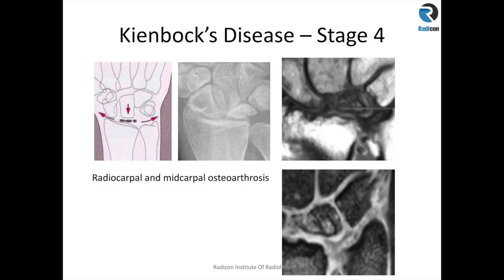Stage 4 is when the lunate undergoes irreversible fragmentation and collapse — it's broken into pieces — and then you get radiocarpal and midcarpal joint osteoarthrosis or osteoarthritis due to advanced Kienböck's disease, as demonstrated on this plain radiograph. On MR, you get fragmentation, collapse, and secondary osteoarthritic changes between the lunate, capitate, and radius, as demonstrated here.